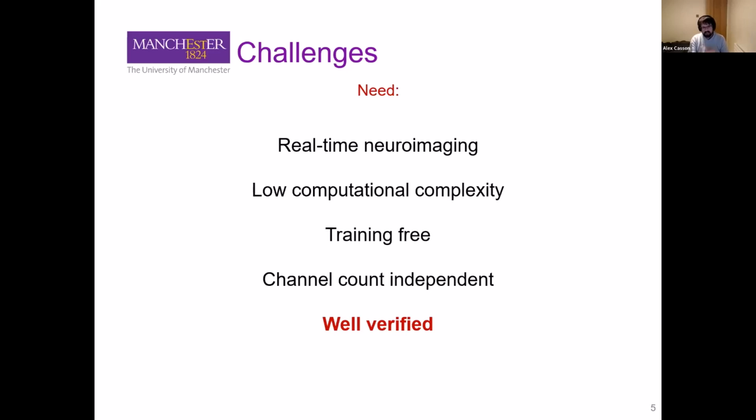And then lastly, and almost certainly most importantly, well verified. It's very difficult to convince people that once you've applied all manner of signal processing, you've actually got true EEG data.